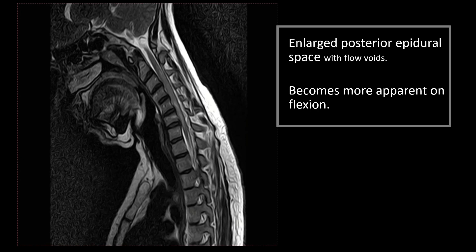Here is a plain T2 sagittal sequence which shows the enlarged epidural space posteriorly. There is effacement of the anterior epidural space and expansion of the posterior epidural space with some heterogeneity, which may be due to flow voids. There is also hyperintense signal in the cord, representing myelopathy due to compression on flexion.